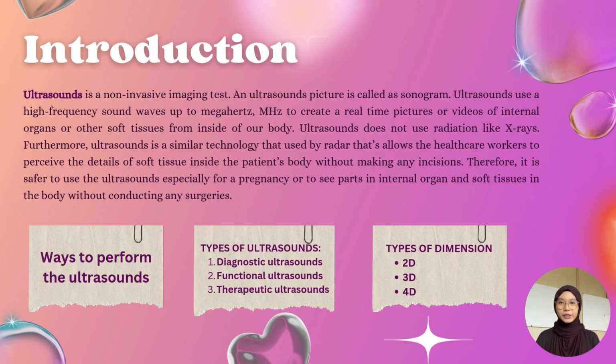For the introduction, I'm going to share about ultrasounds. Ultrasound, also known as sonography or ultrasonography, is a non-invasive imaging test. An ultrasound picture is called a sonogram. Ultrasound uses high-frequency sound waves up to megahertz to create real-time pictures or video of internal organs or other soft tissues from inside of our body. Ultrasound does not use radiation like X-rays.